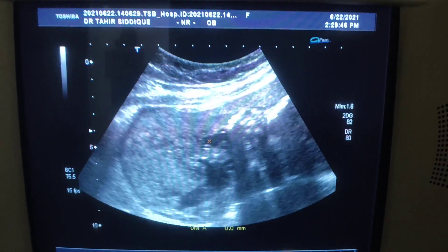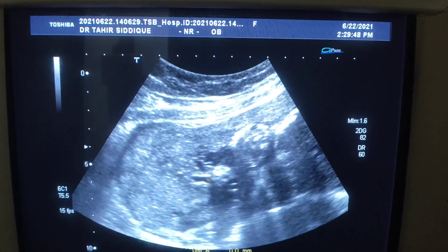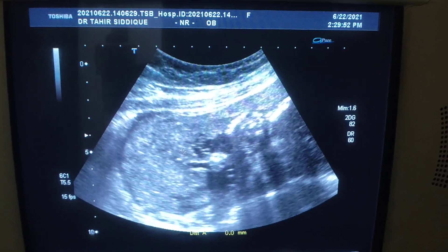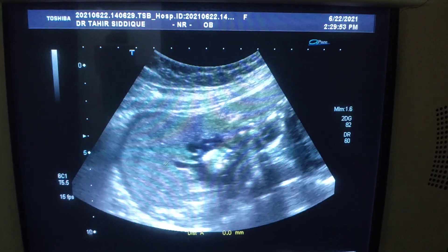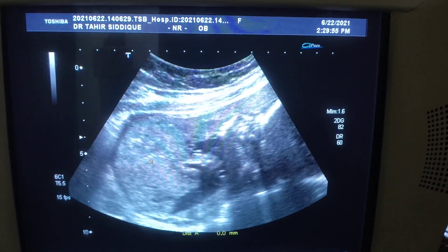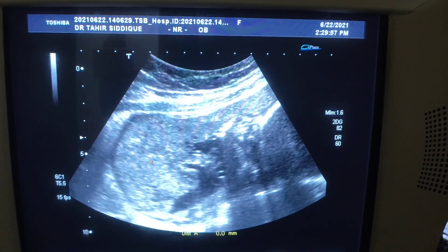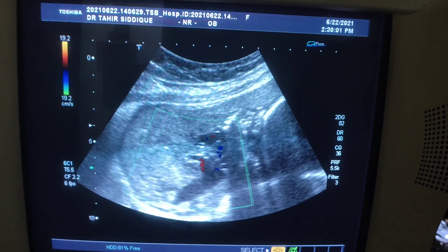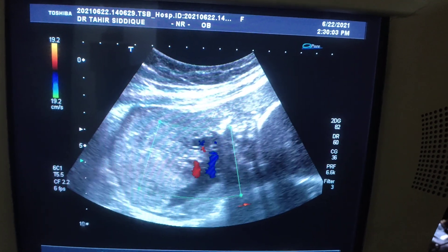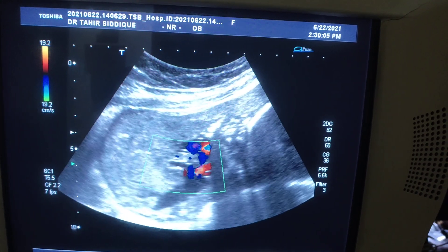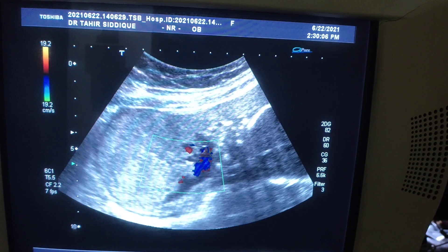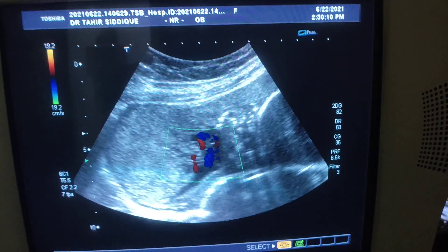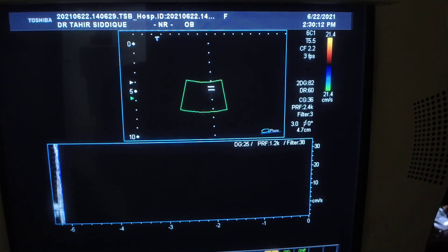Here you can see the umbilical vessels emanating from the placenta. There is no fetal cause identified. This is 24 weeks gestational age. The kidneys can be seen, and there is no CNS abnormality.